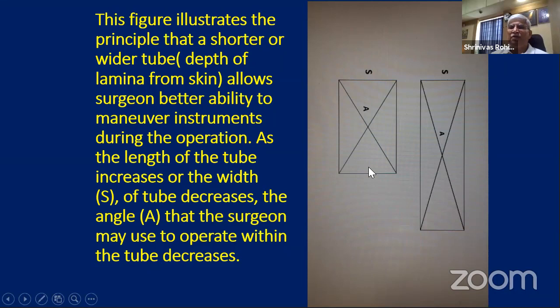You can use it in a thin patient. This is a longer tubular retractor for an obese patient. Usually the Americans and Europeans need a longer tubular retractor.